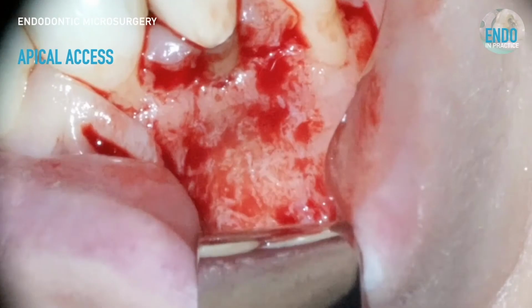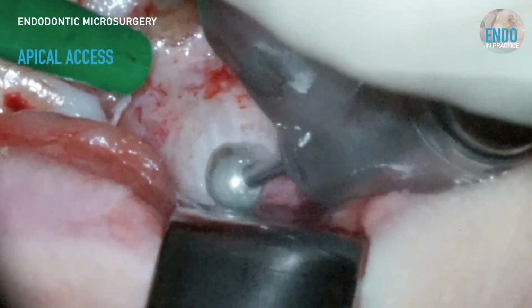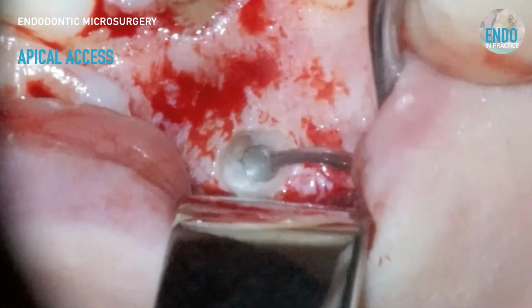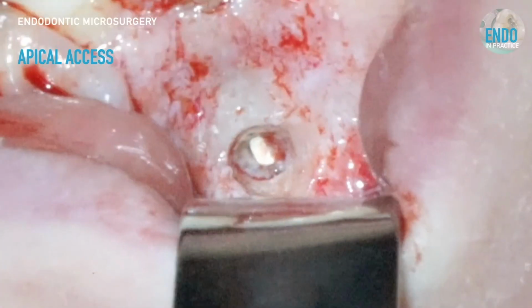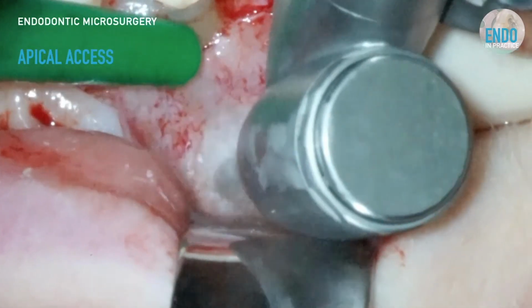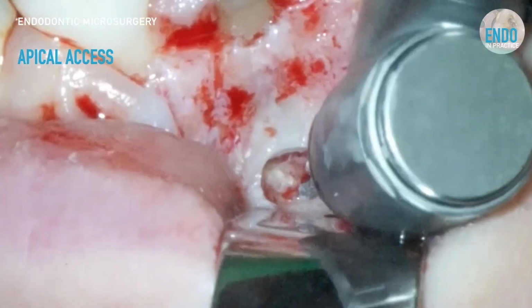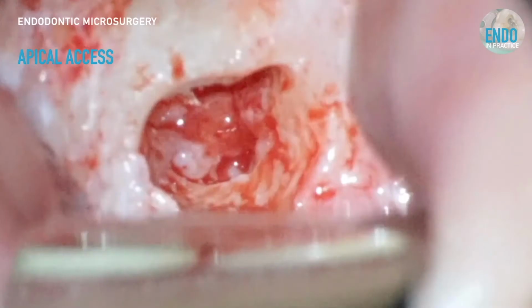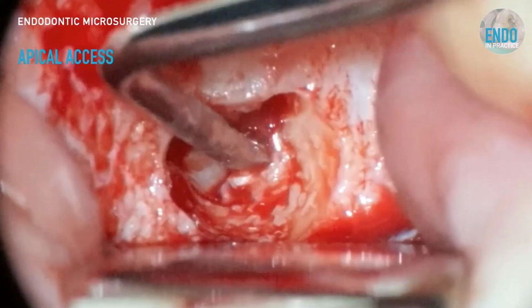Sometimes the lesion hasn't perforated the labial plate. So this is a round 5mm diameter diamond grit burr that I'm using, and you can see I'm accessing the lateral incisor. And at this point, I'm thinking, oh dear, where's the periradicular lesion? Have I accessed the wrong tooth? So again, I go and remove the root end, and because a lateral incisor tips palatally, you can now see the actual lesion is or was palatal to the root tip itself, and then you can debride that.